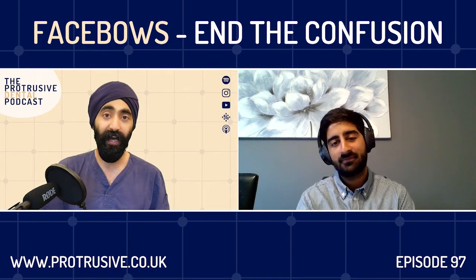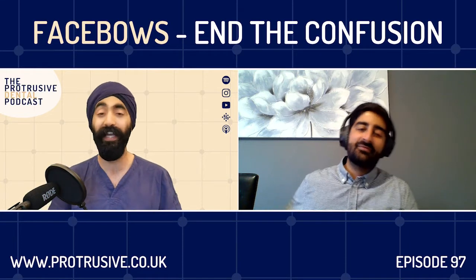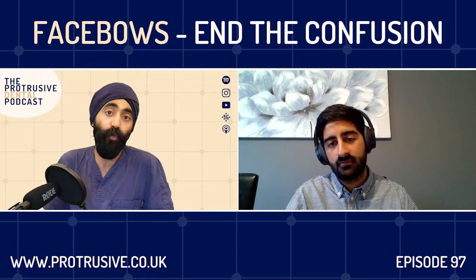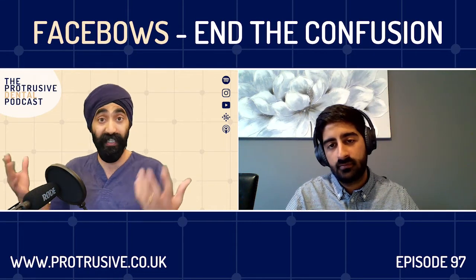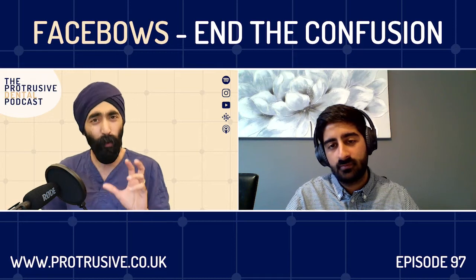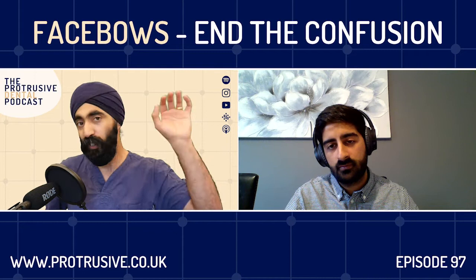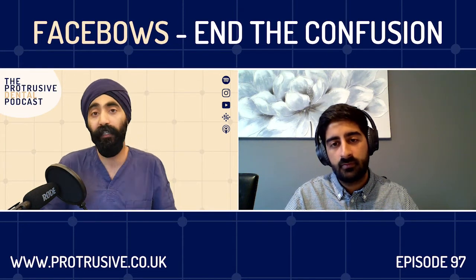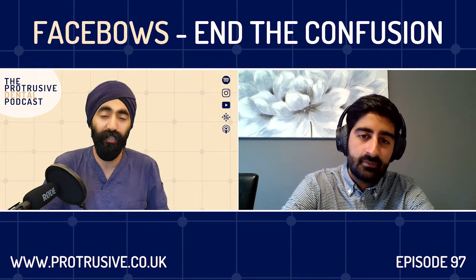Food for thought. Salman, thanks so much for coming on and sharing what you've been learning in your program and what you've been applying. The main takeaway today is think of cants, think of using that little putty technique, perhaps instead of the microbrush technique, stick bite if you're already using stick bites. But also now, if you're someone who has been afraid of that Facebow in the corner, just pick it up, use it, speak to your lab, and it can give lots more information to your technician. Then the ultimate aim is to reduce how much you've got to do.